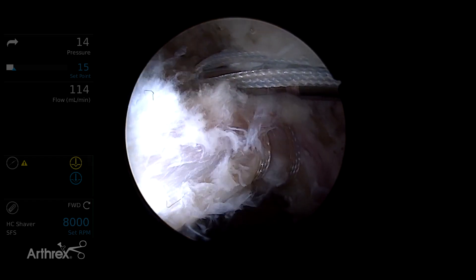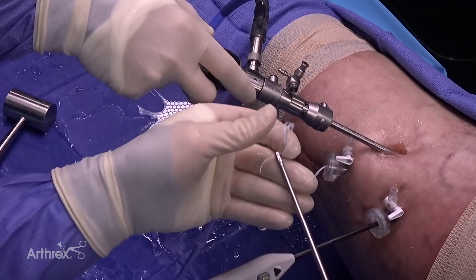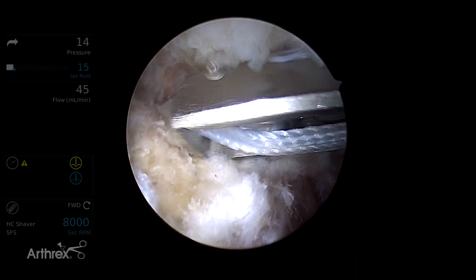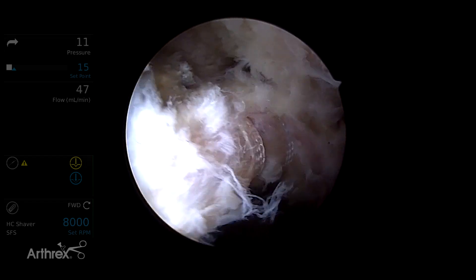A small sound change can be used to confirm that the anchor is fully secured. Once the inserter is removed, the suture tape cutter is loaded as an end-loading system and, through the DALA portal, it is easily placed and cut. It is an end-cut suture — ease of passage, minimal soft tissue injury.